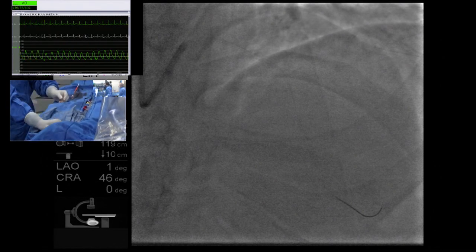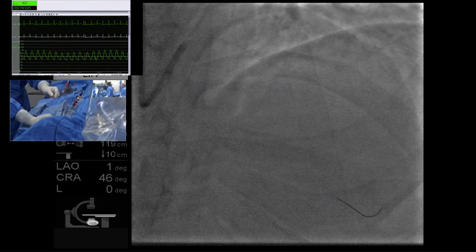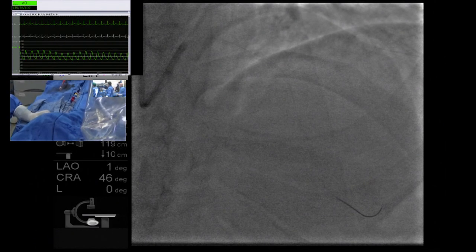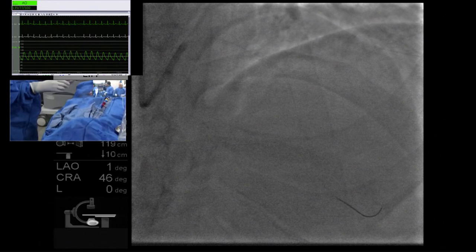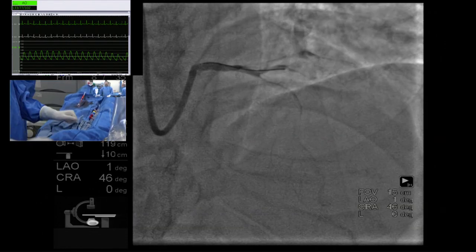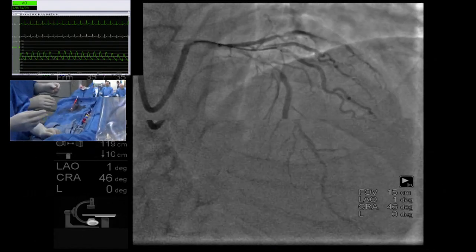It's a great explanation, and just as a lesson, if things don't fit, if it angiographically looks tight, but you're not getting an area on IVUS that fits, just think about whether you maybe weren't coaxial. I think these things are all about the company that they keep as well, right? So you've got a patient who's got an EF of 25% with multi-vessel disease in a branch vessel. That's a good reason to have a poor EF, right?